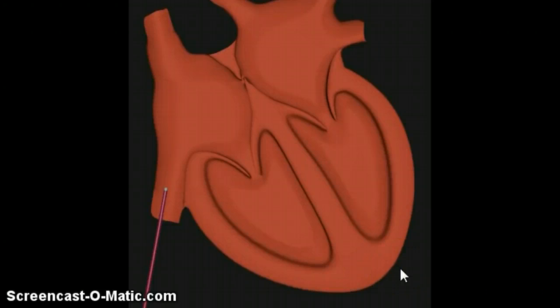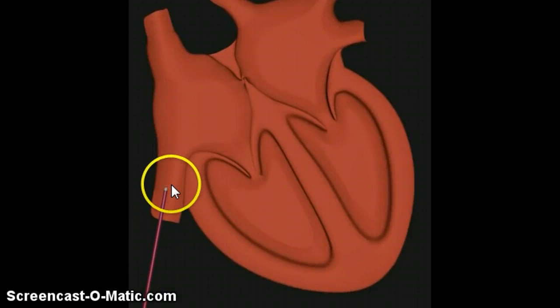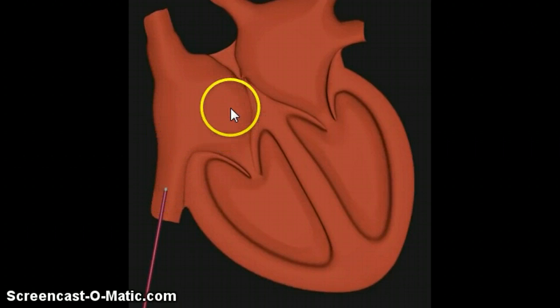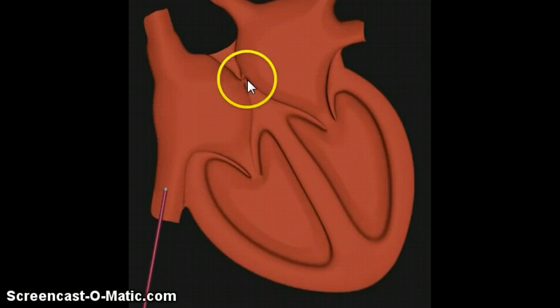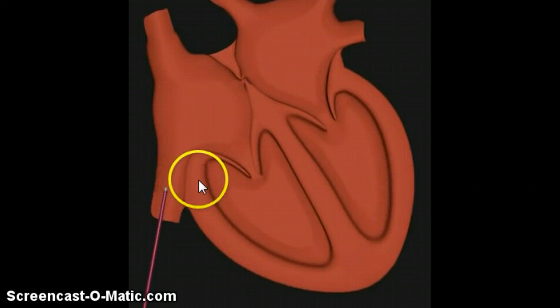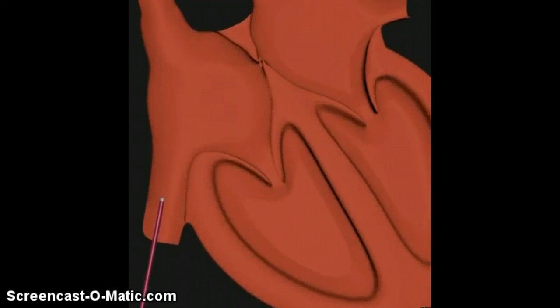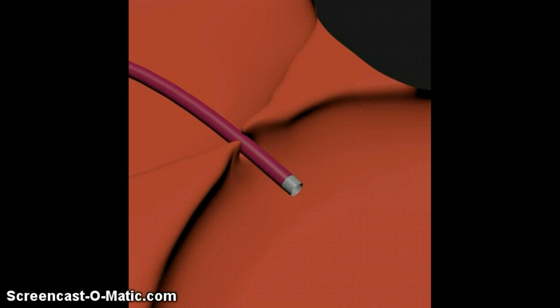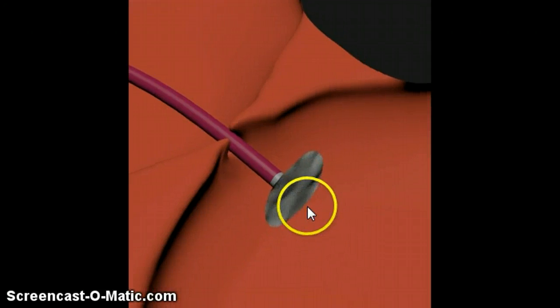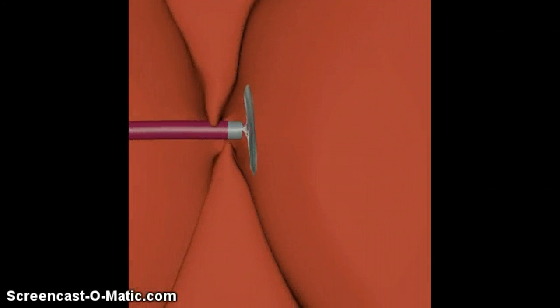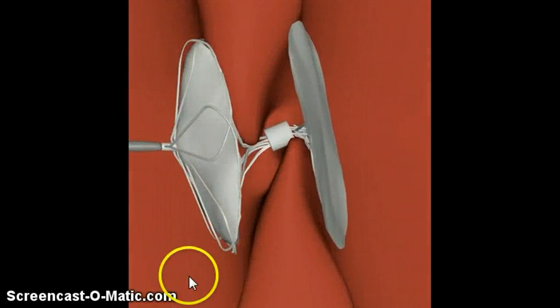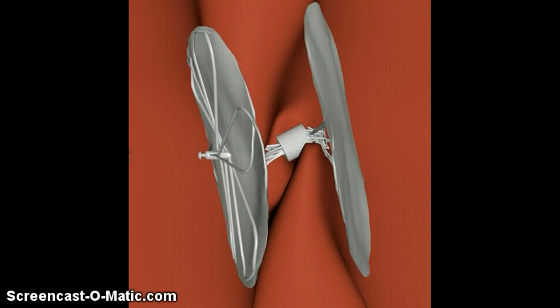Here is a video demonstrating how the PFO closure device is deployed. This is the inferior vena cava, going through the vena cava into the right atrium. Here it is showing the patent foramen ovale, or the PFO. The catheter is now in the left atrium. They deploy that side of the disc, and then the other side of the disc is deployed. That's how a PFO closure is deployed.